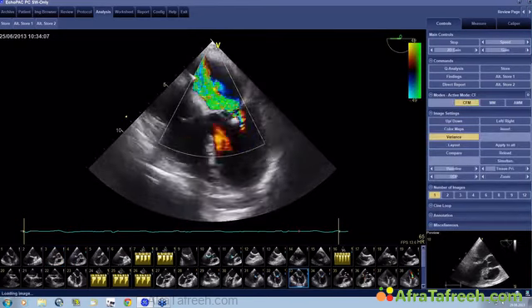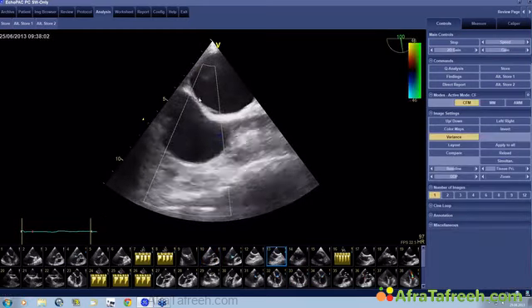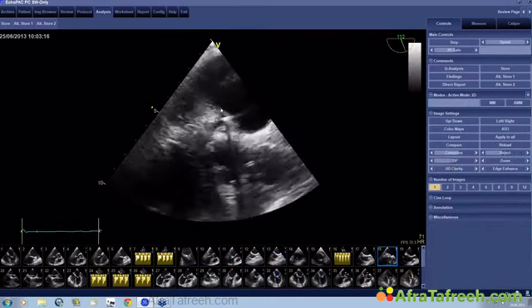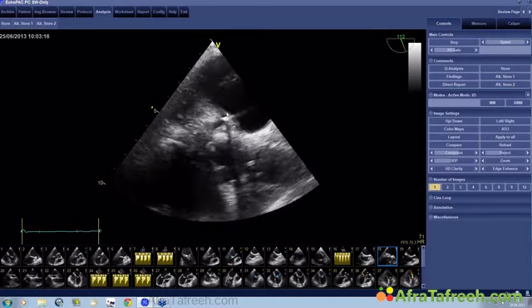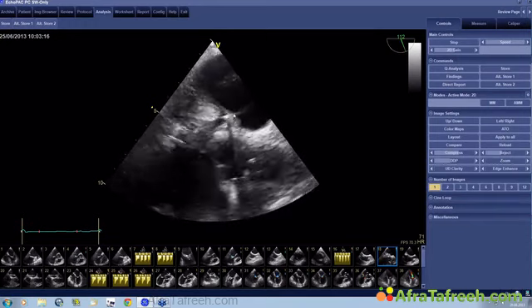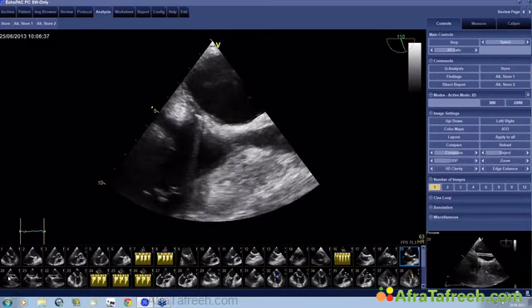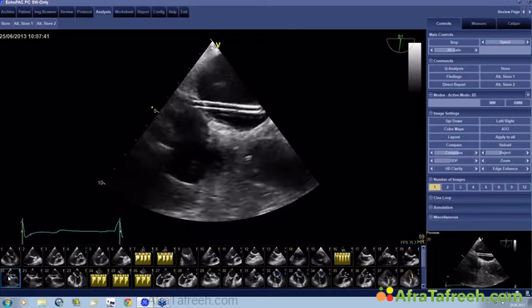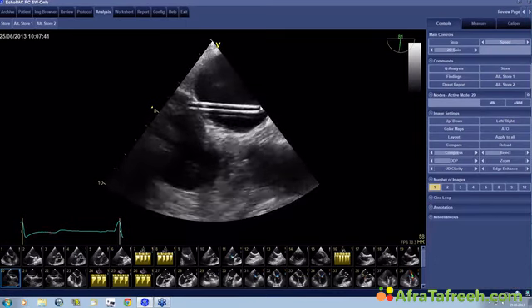And then we went on and performed the typical transseptal puncture. You try to find the right spot to go through there. Then you put the needle through. Here you see the interatrial septum. This is the secundum part. This thin part here is the primum septum. There is the needle, you see it right here. And then you poke it through and you see the tenting. And if you're lucky, you can see all of a sudden this tenting pop, and the needle going right through the interatrial septum. And then you put the introducer through.